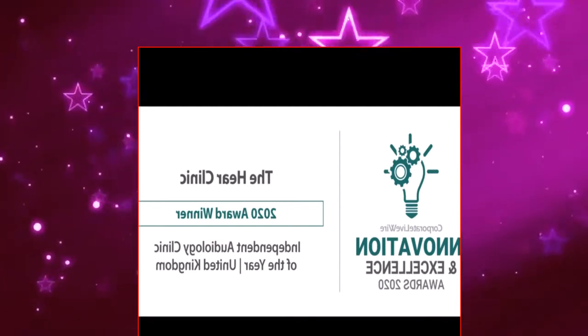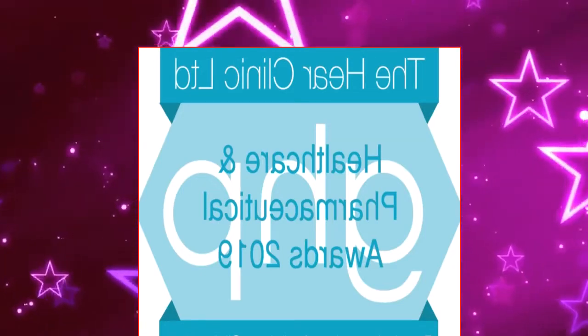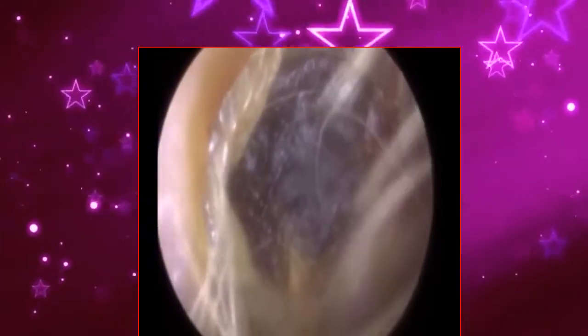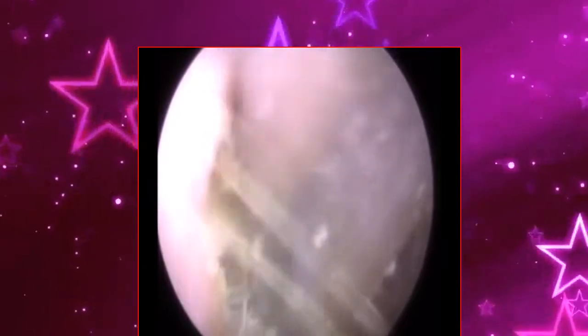This patient previously had a cholesteatoma in the superior posterior quadrant of her eardrum, which is the top rear of her eardrum, and that cholesteatoma caused erosion of the bony part of the ear canal. The patient also underwent further surgery to remove some of the mastoid bone because that got infected because of the cholesteatoma. A cholesteatoma is a collection of dead skin that collects in a pocket at the top of the eardrum in the pars flaccida, or what we call the attic.